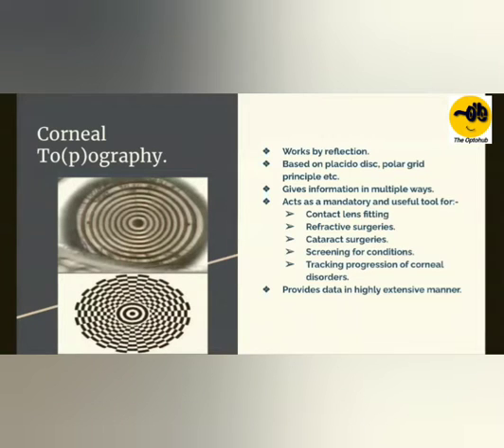The topographer is extensively used in contact lens fitting. Anyone who is practicing specialty contact lenses knows how good and how useful corneal topography is in contact lens practice. I'm not saying that it's compulsory to have a topographer at your place, but believe me, if you have a topographer at your place and you're a contact lens practitioner, wow, you're doing the best practice. The corneal topographer is also used for pre-cataract assessment, in order to plan the incisions for the surgery, and so on.